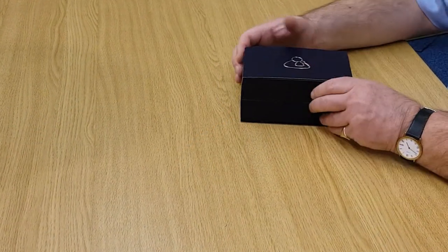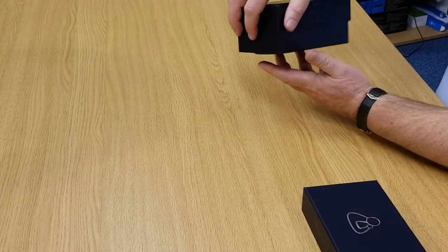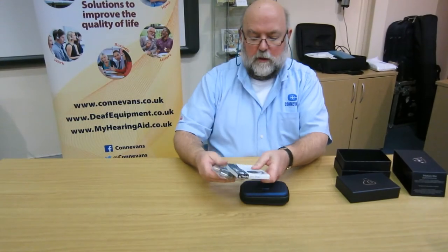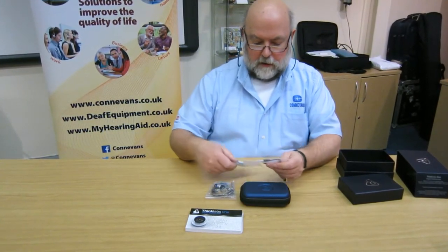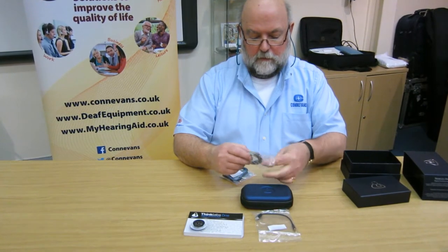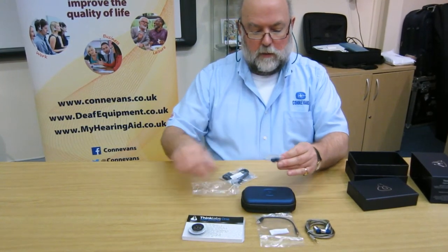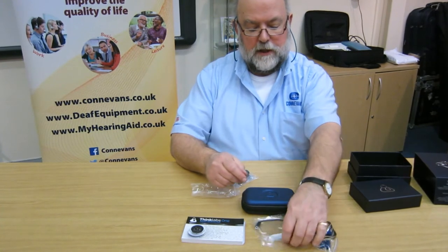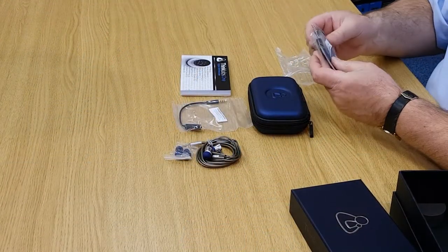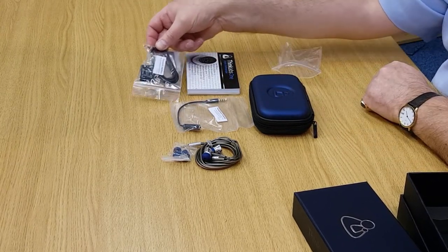Here's the box. So we have an instruction book, audio patch cable, and a set of earphones with some alternative earbud tip sizes. That's a four pole connection so that you can plug it into your mobile phone. Here we have one of the modes that you can switch between — plugging it into your laptop and headphones — that's that switch.